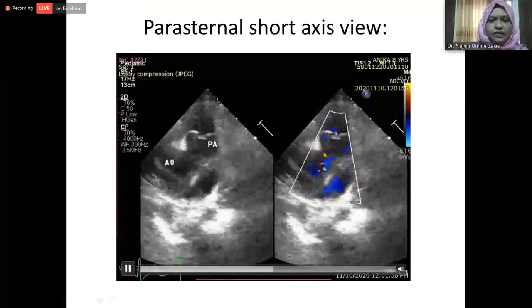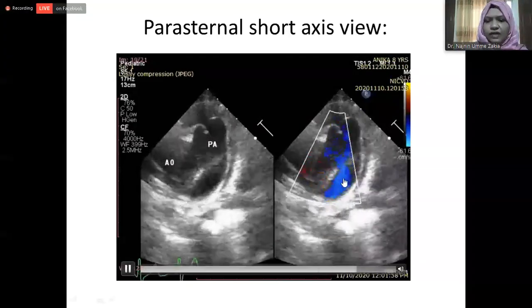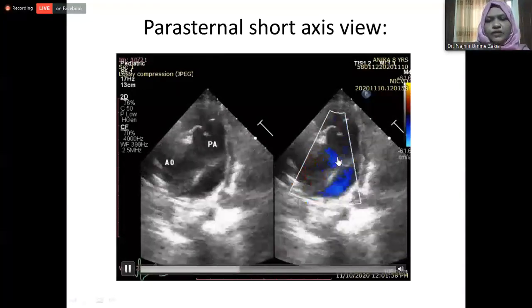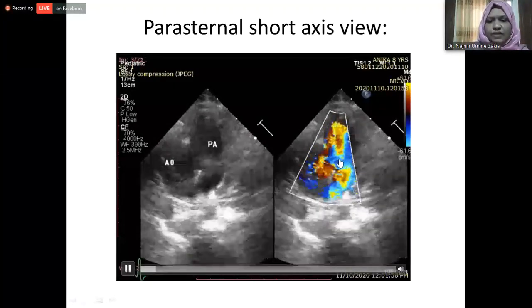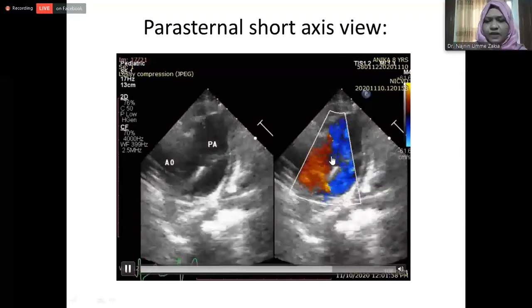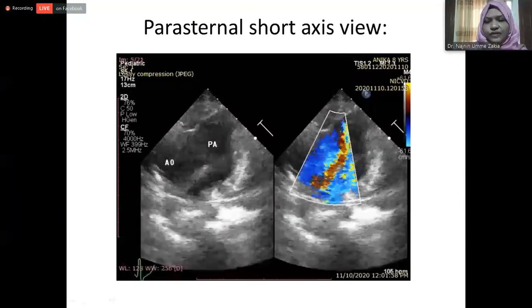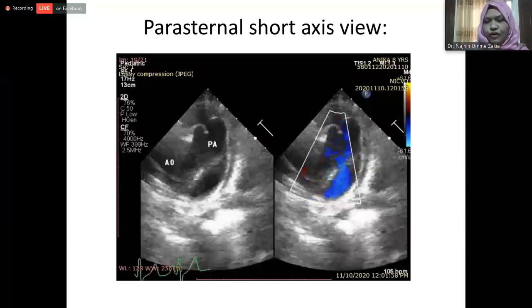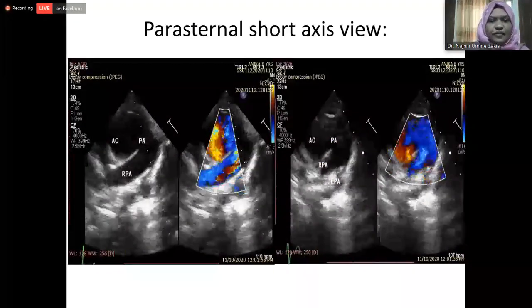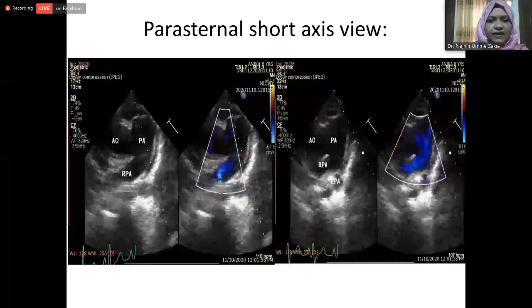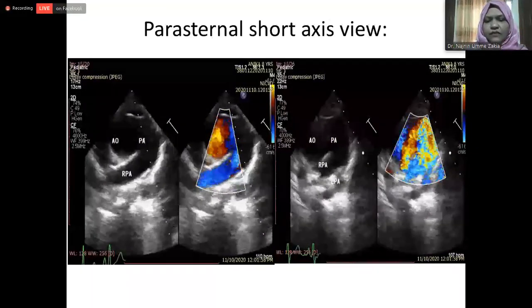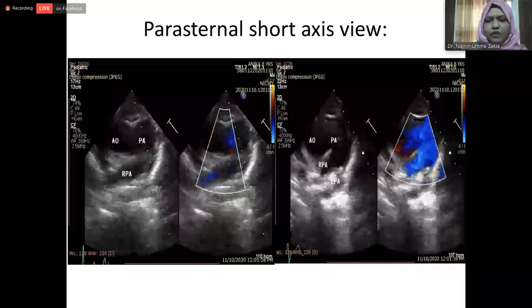The defect is closer to the semilunar valve, that is the pulmonary valve. This is the aorta and this is the pulmonary artery. On color flow interrogation, there is laminar flow between the aorta and pulmonary artery. As the defect is large, pressure is similar in both aorta and pulmonary artery, so there is laminar continuous flow with no significant turbulence. We can see the clear bifurcation into right and left pulmonary artery.